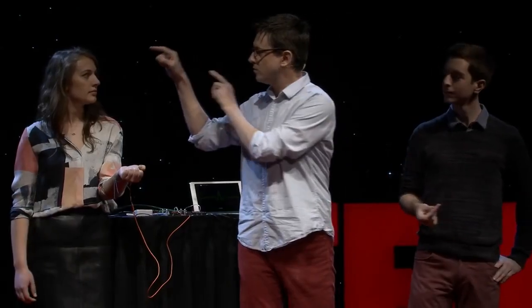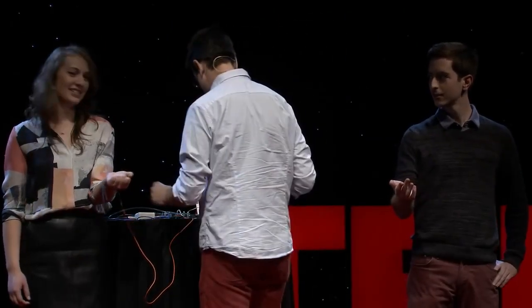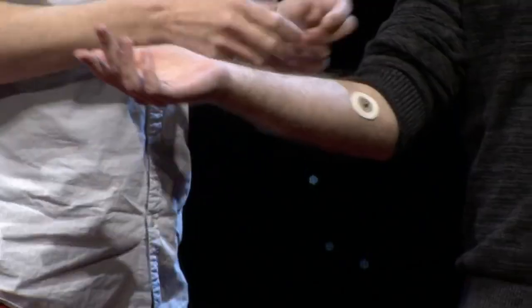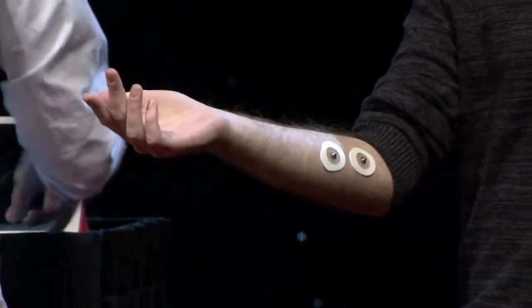So what we can do is copy your brain signal that's going out to your hand and inject it into your hand so that your hand will move when your brain tells your hand to move. In a sense, she will take away your free will, and you will no longer have any control over this hand. You with me? So I just need to hook you up. I'm going to find your ulnar nerve, which is probably right around here. You don't know what you're signing up for when you come up here.